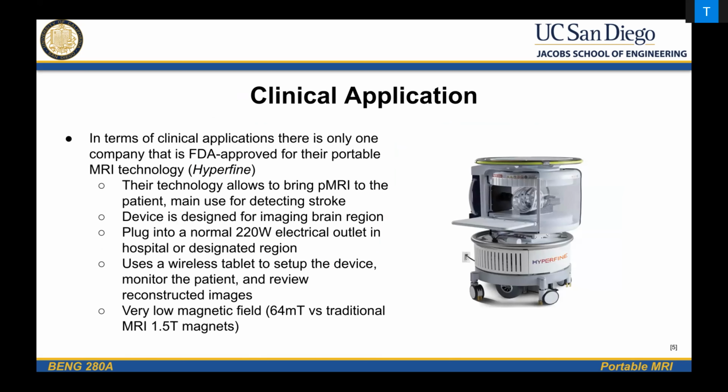In terms of clinical applications, there's only one company that is FDA approved for their portable MRI technology, known as Hyperfine. Their technology allows bringing portable MRI to the patient, and their main use is for detecting strokes in humans. The device is designed for imaging the brain and head region, and you can plug it into a normal 220-volt electrical outlet in hospitals or designated remote regions.